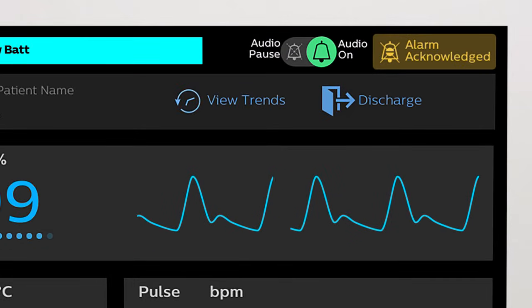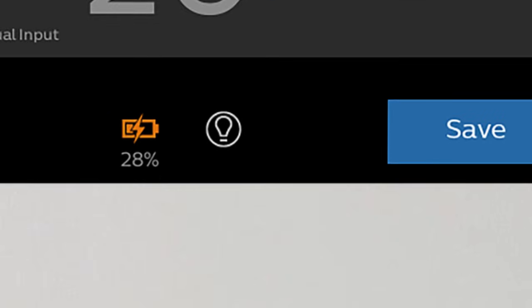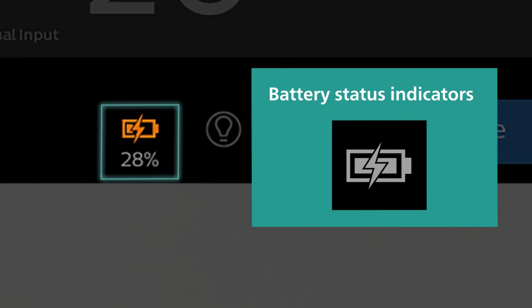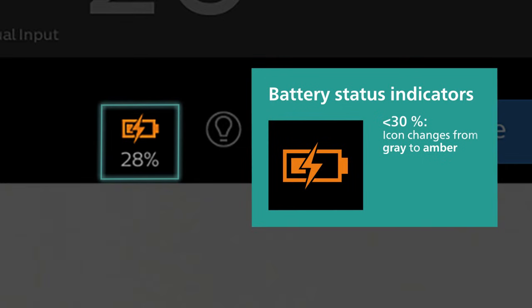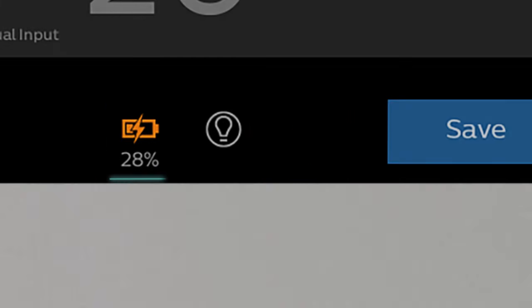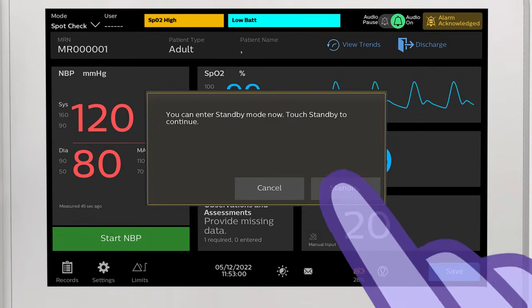Alarm audio can also be paused using the audio control. Battery status appears at the bottom of the main screen. The battery icon changes from grey to amber when battery power drops below 30%, and from amber to red when battery power drops below 21%. If battery power drops below 12% and the VS30 is not connected to AC power, the monitor shuts down. The VS30 must be connected to AC power and placed in standby mode to charge, and does not charge when shut down or turned off.